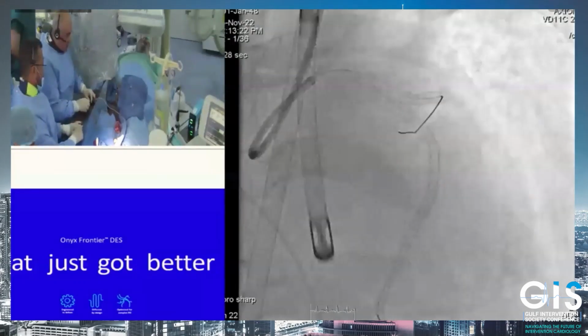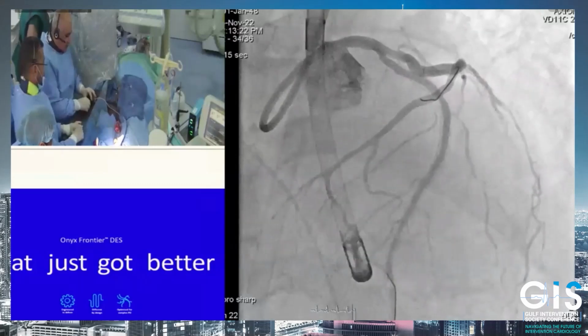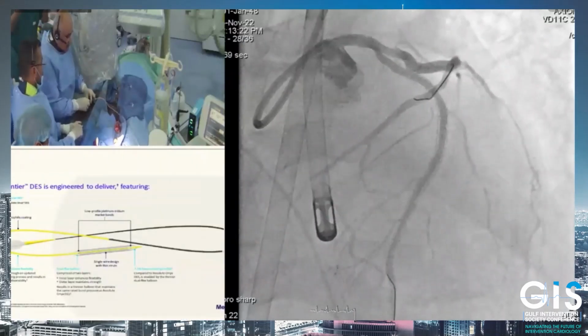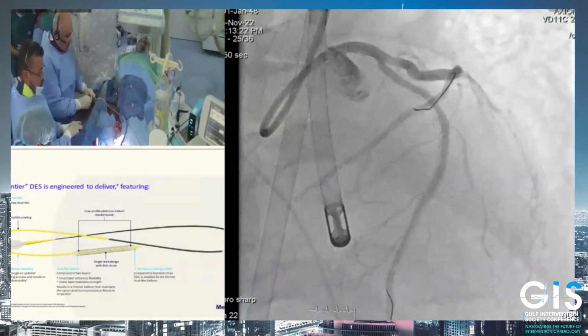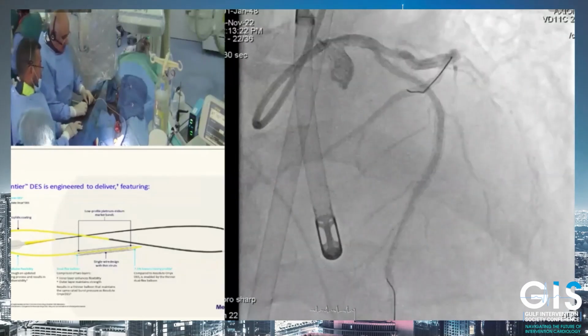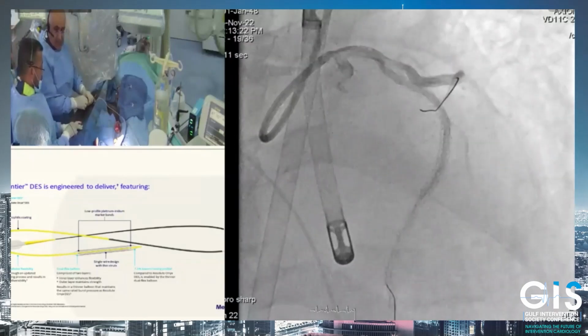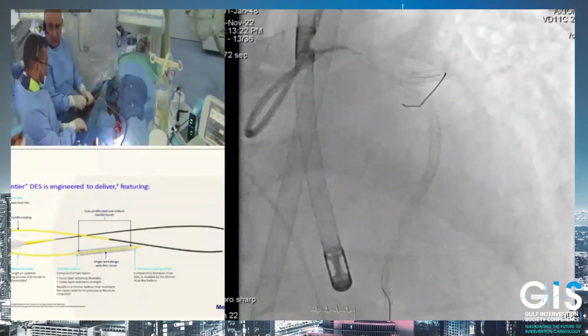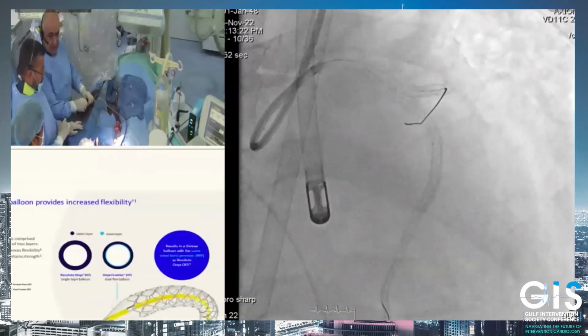First of all, Mohammed, I will do it for the sake of education, just to see what is happening. I don't think that will affect my strategy much. First of all, I had information from my previous IVUS at the proximal stent. Second, there is no significant in-stent restenosis, so I don't think there is a failure of the stent.